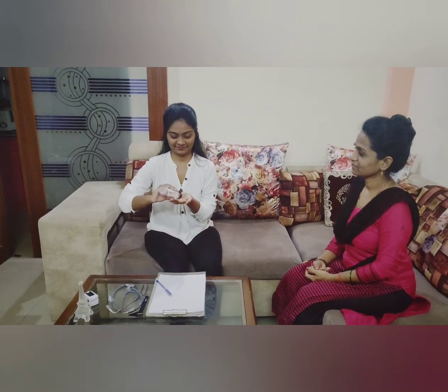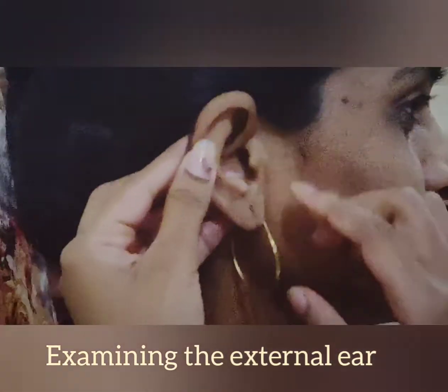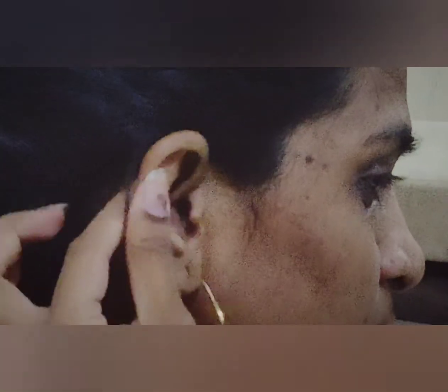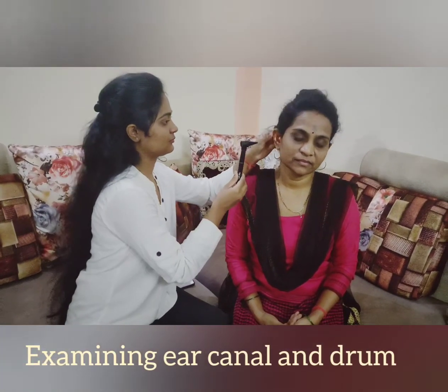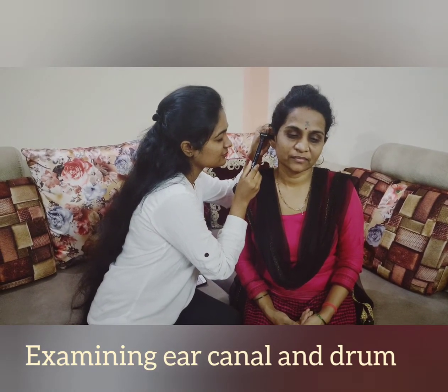Okay, so now I'll examine your ear. Now I'll inspect your auricle and look for any deformity or skin lesion or lump. To see the ear canal and drum, use an otoscope with the largest ear speculum that inserts easily into the canal.